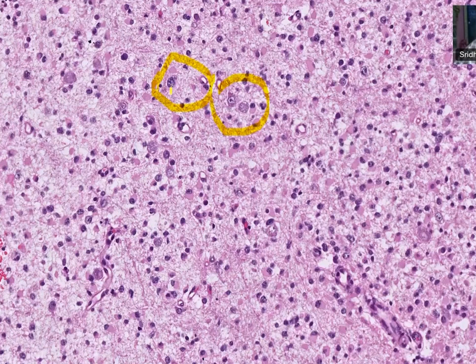So which one are you talking about? Are you able to see the pointer? I marked to encircle two cells. Are you able to see that? Yes, sir. You could make out this one cell here and this cell here. Are the two similar? No, sir. So what do you feel? How do you describe this cell and how do you describe this cell?